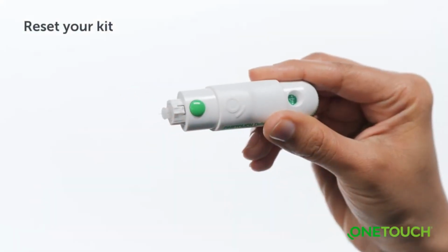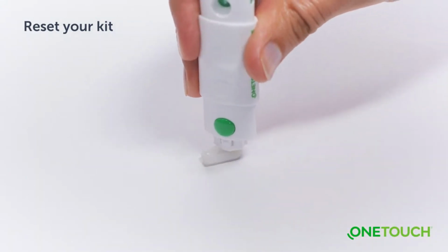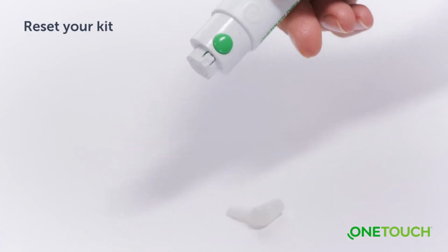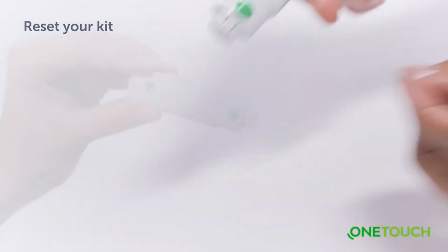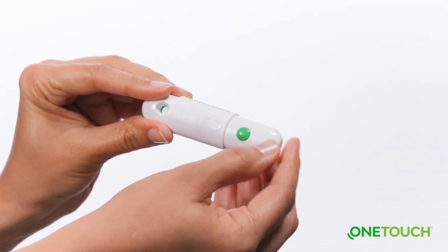When testing is complete, simply remove the used test strip, then apply the safety cap to the end of the used lancet, eject it, and replace the OneTouch Delica Plus lancing device cap. Discard the used lancet and test strip carefully after each use.